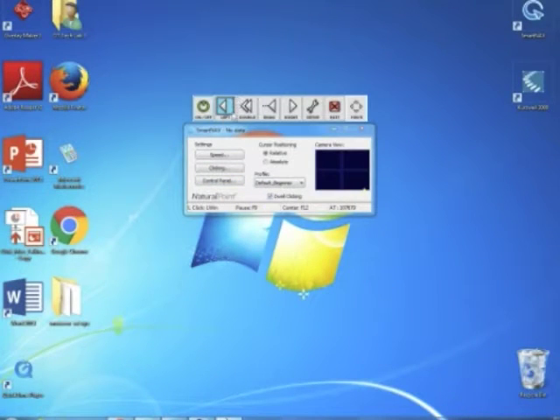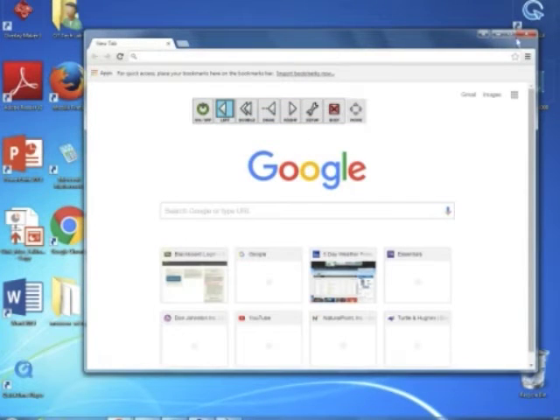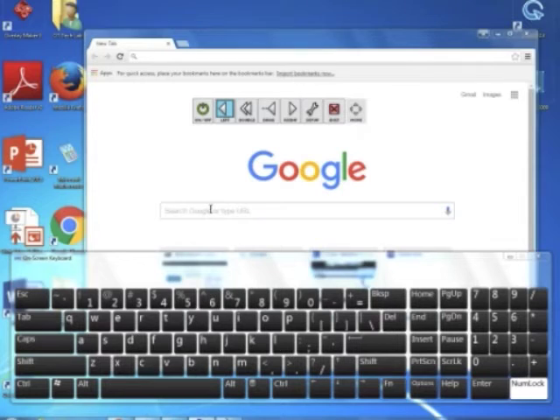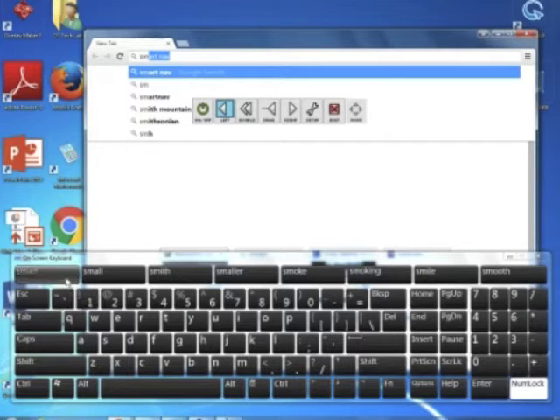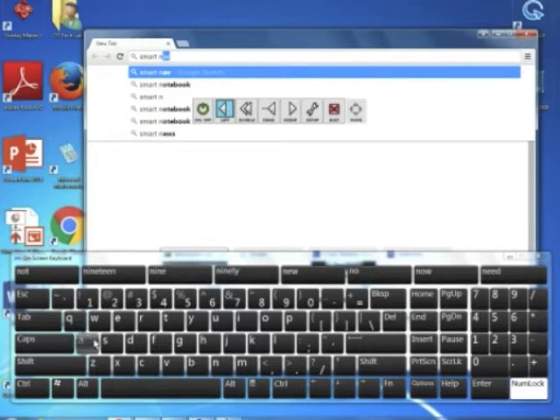To enable dwell clicking, check the dwell clicking box and the toolbar will pop up. You can now alternate between a left or right click, double clicking, and dragging. The default option is represented in blue and the one-time click option is represented as a dashed outline. Now all you need to do to produce a click is to hover the cursor over your intended target. To type, pull up the on-screen keyboard through your ease of access settings as you normally would, and select each letter using dwell click.